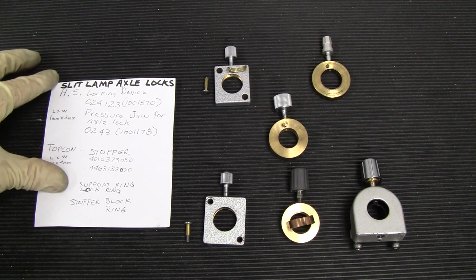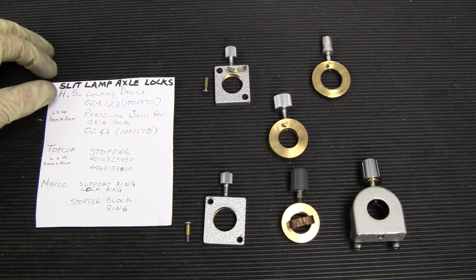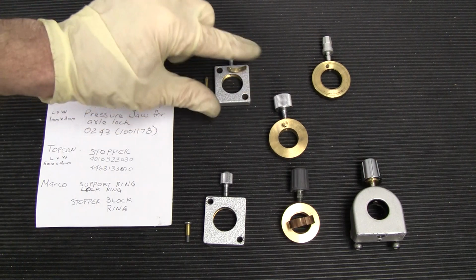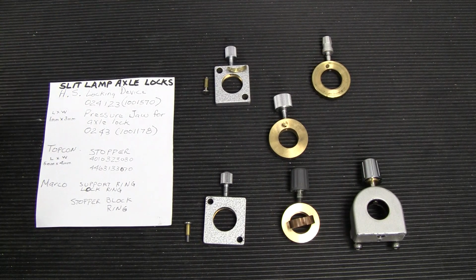On your slit lamps, you have various ways to lock the axle in place, and the locks can either be on the outside of the base housing or on the inside. Various brands have different ways of doing it, but these are some of the different types you might find.